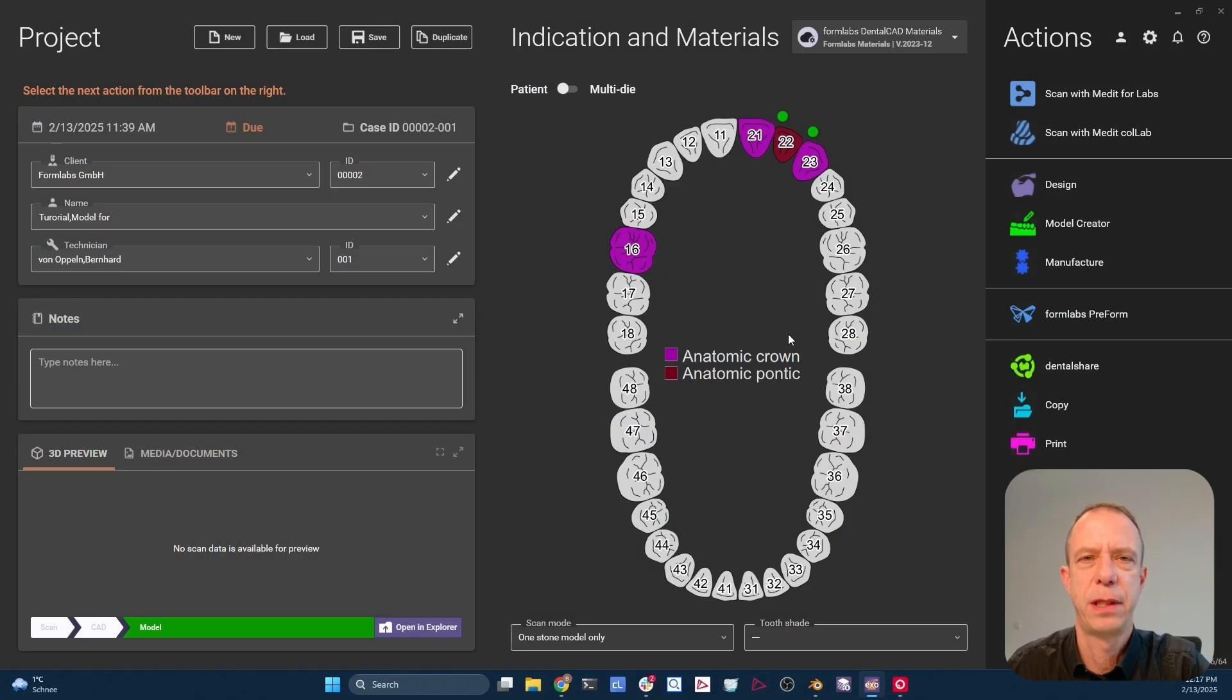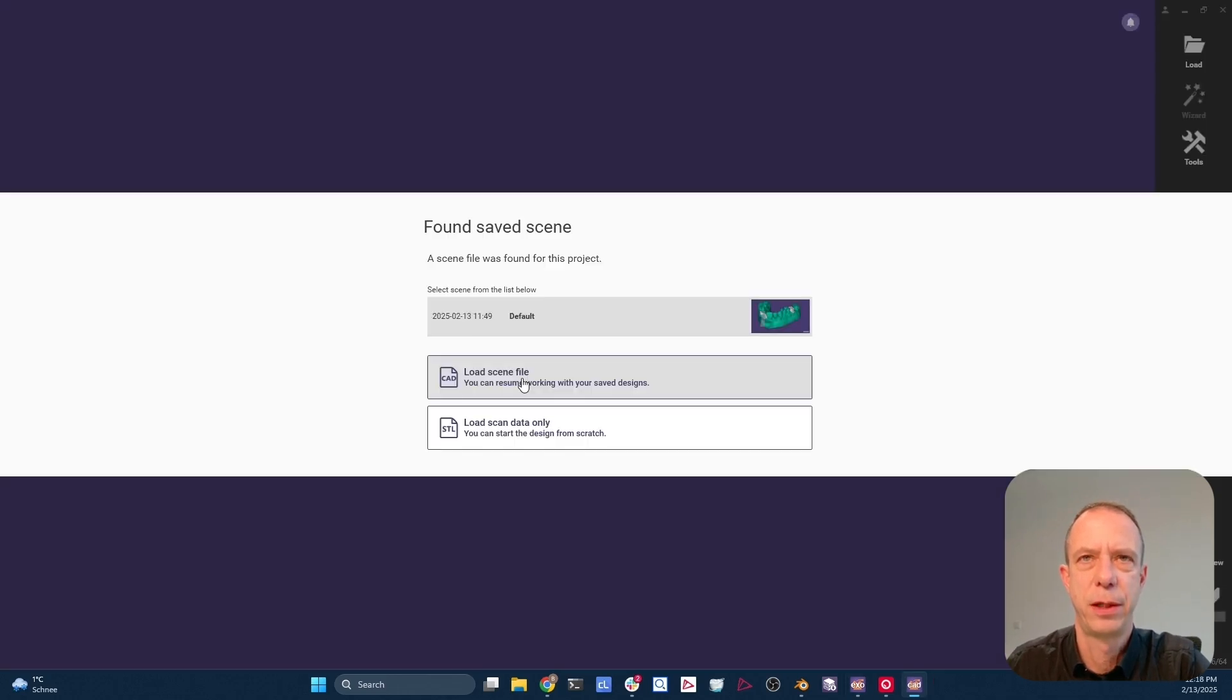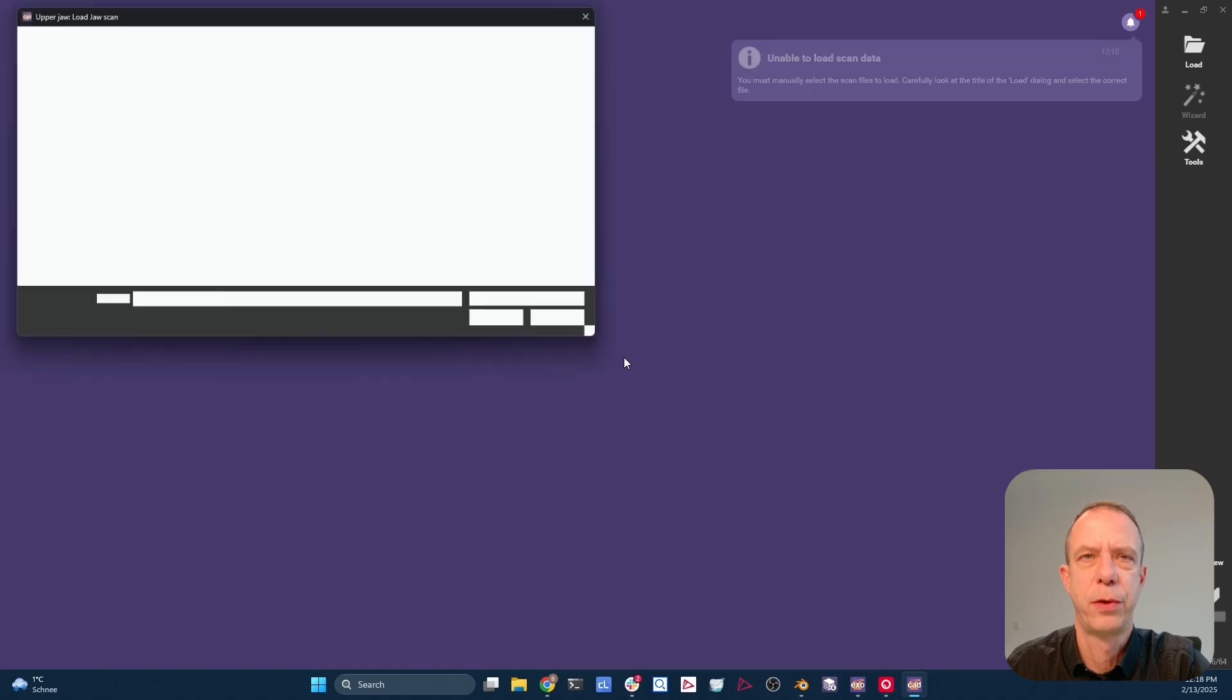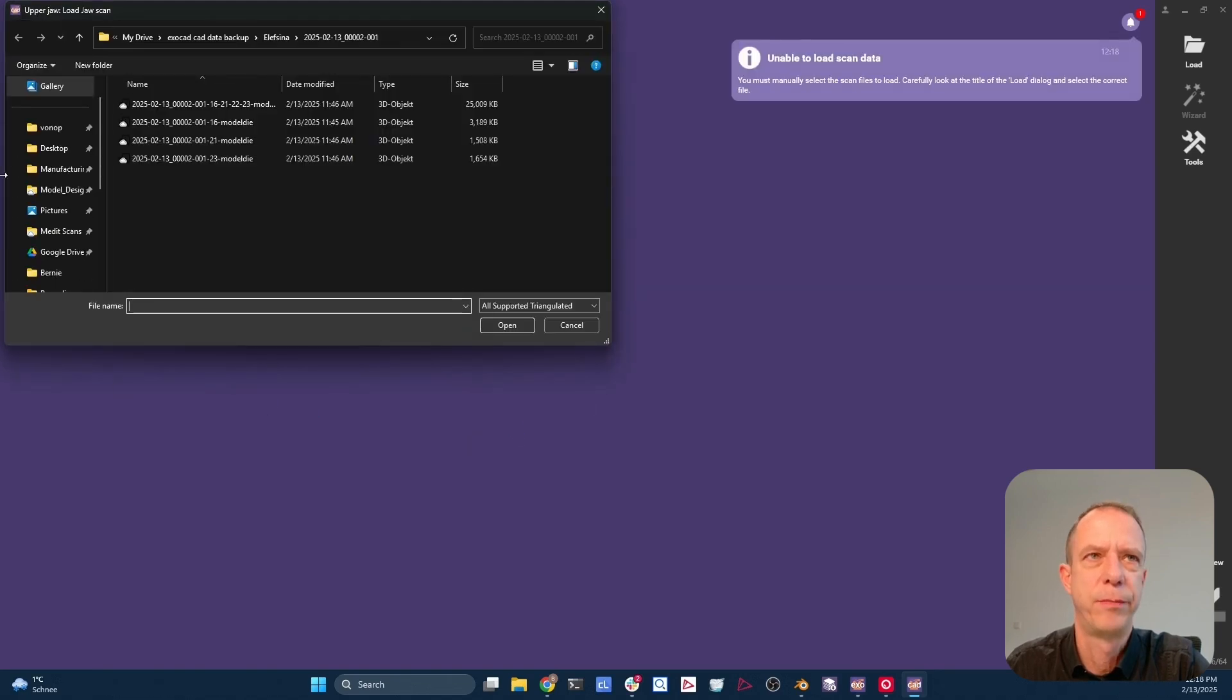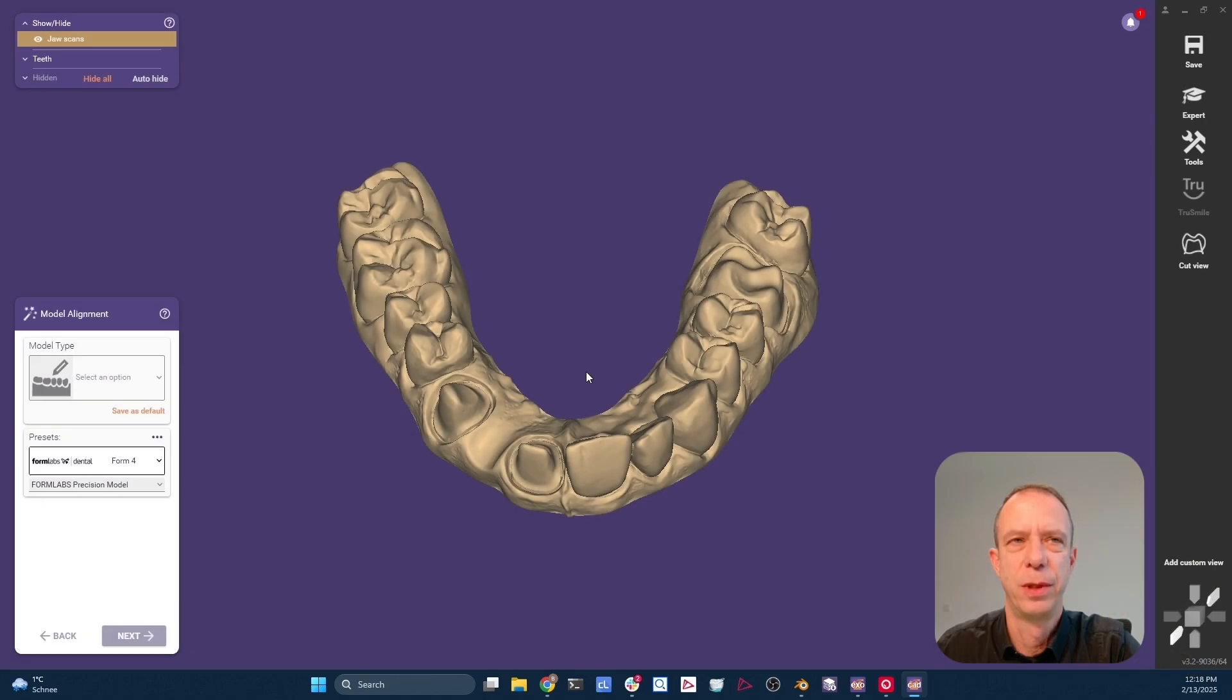I have set up a case in ExoCAD where we have one crown and an anterior bridge. So let's dive directly into model creator. You see I already have a saved file. For the purpose of this video, we're going to just load the raw scan data, which is in this case located on my desktop. Here it is. If you have installed the libraries like I showed you in the second episode, you will find them easily.